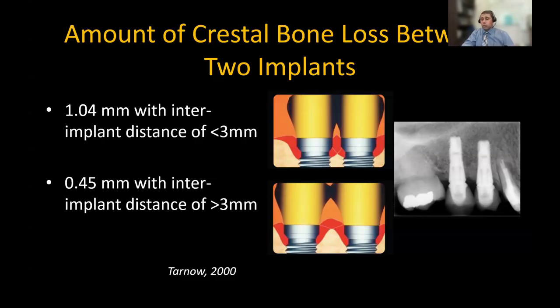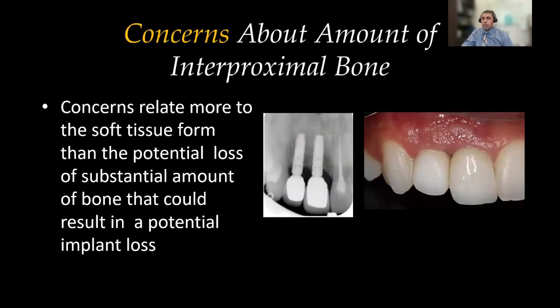So how much distance do we need between adjacent implants? A minimum of 3 millimeter. With platform switching, that can be a little bit less, but still try to respect that 3 millimeter distance. We achieve very good outcome because it can be very, very challenging. Similar to what you see in this case, two implants next to each other, and you appreciate that we have a little bit of bone loss between the implants, and now we have a longer contact and not an ideal interdental papilla.